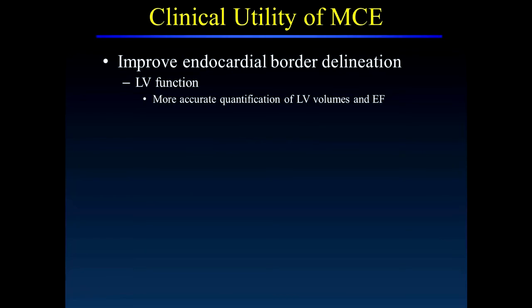For the rest of this presentation, we will move to discussing the clinical utility of contrast imaging. As all of you know, the assessment of left ventricular systolic function is the most common indication for ordering an echocardiogram. Contrast for left ventricular opacification has really enhanced the accuracy of quantifying left ventricular volumes and ejection fraction.